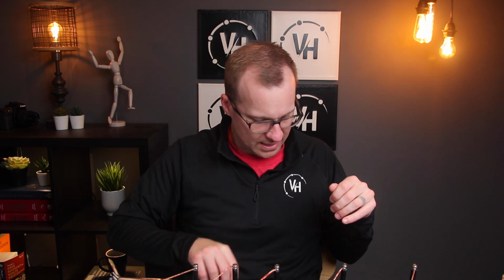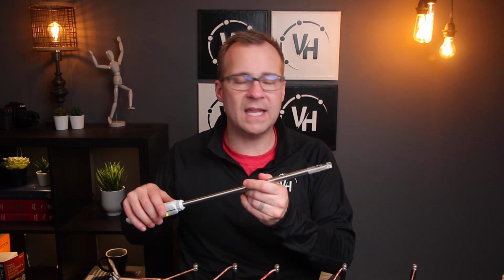And sometimes, as I'm dissecting or trying to work that out, I've looked and thought, oh, there's a huge branch there. That's the problem. And I go to cauterize it, and then I think, well, is that a branch or is that my saphenous? I have actually, in one case, and I'm embarrassed to even say this, transected a vein right at the knee because I was confused as I had pulled it out, and I was thinking it was connective tissue. So I just went in with the V cutter, thinking, oh, that's my problem.